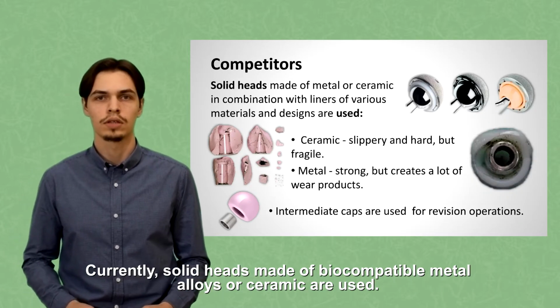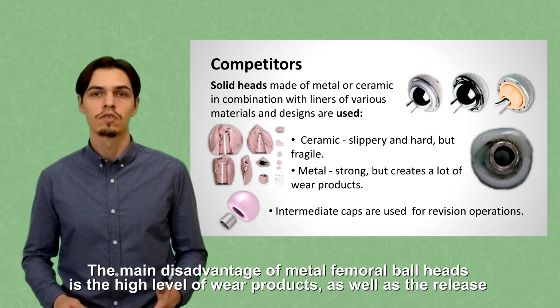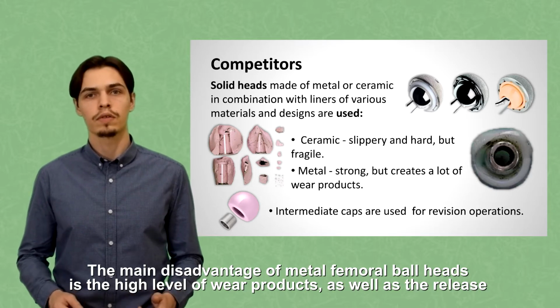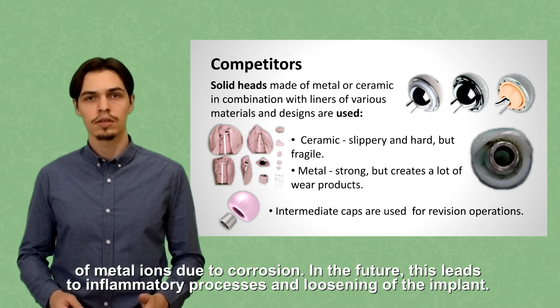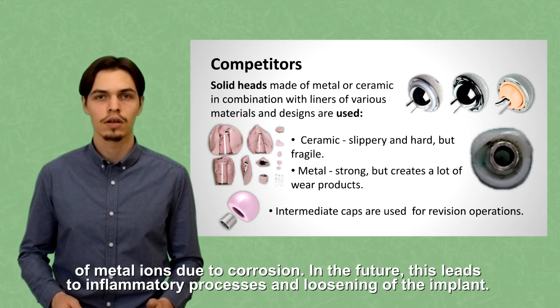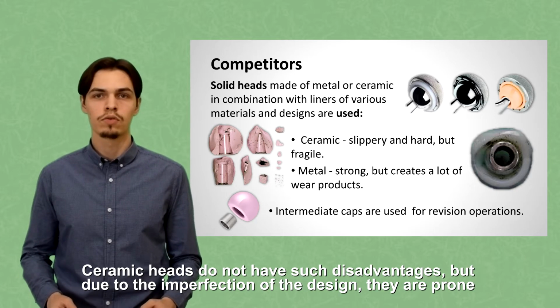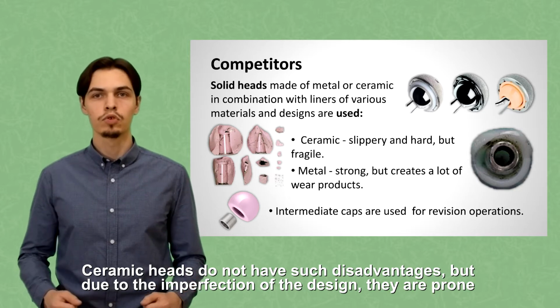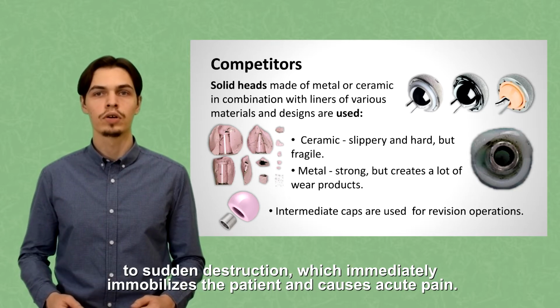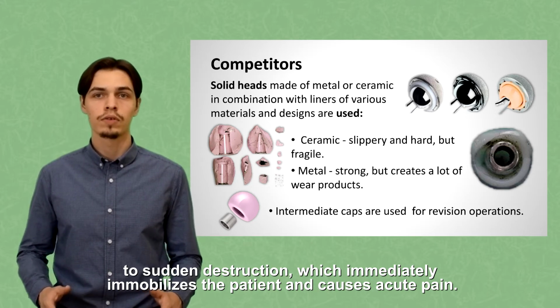Currently, solid heads made of biocompatible metal alloys and ceramic are used. The main disadvantage of metal femoral ball heads is the high level of wear products, as well as the release of metal ions due to corrosion. In the future, this leads to inflammatory process and loosening of the implant. Ceramic heads don't have such disadvantages, but due to the imperfection of the design, they are prone to sudden destruction, which immediately immobilizes the patient and causes acute pain.